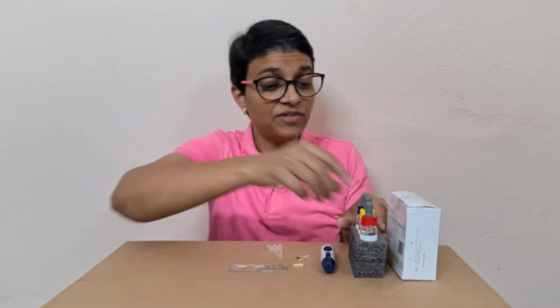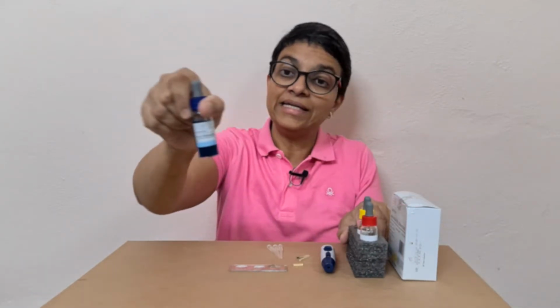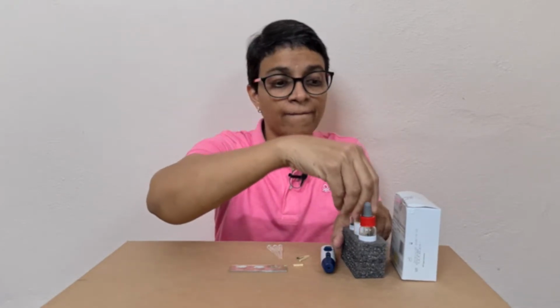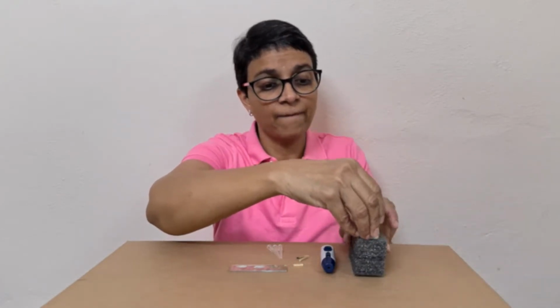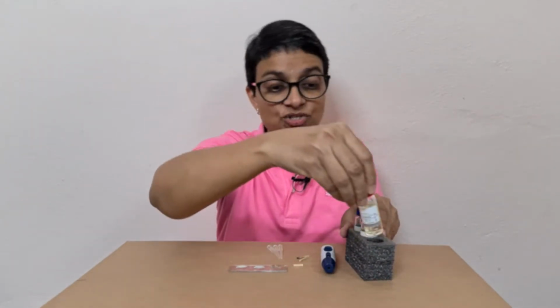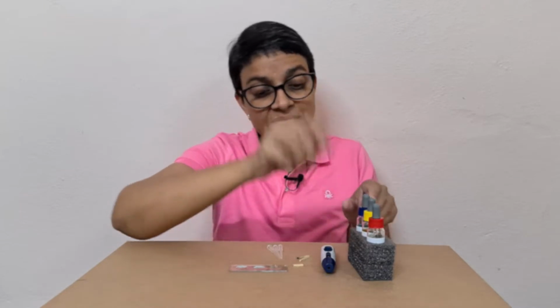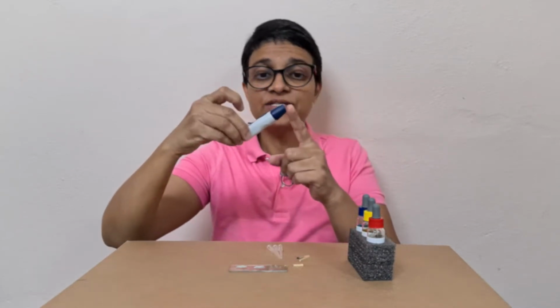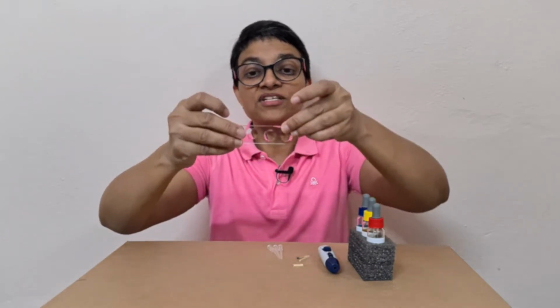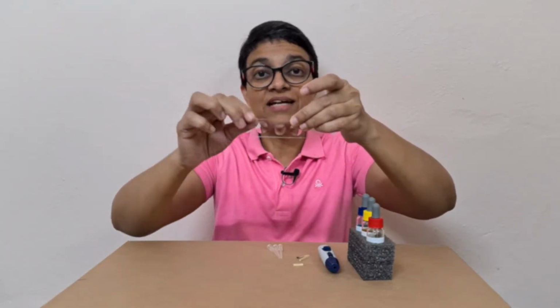We'll be needing the blood grouping kit, wherein we have anti-A, anti-B, and anti-D or anti-RH. We will be needing this kit, one lancet to get the blood, and then a depression slide, a 3 cavity depression slide we call it.